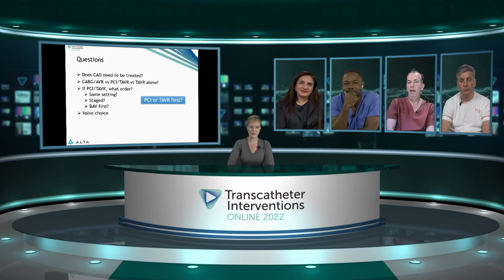I was just curious. Yeah, I mean, we would. Specifically, we would not treat this first. We would treat the valve. As long as the valve was unequivocally severe, we would treat that first. If the patient had symptoms of angina after the TAVI, we would then treat the LAD. Mm-hmm.